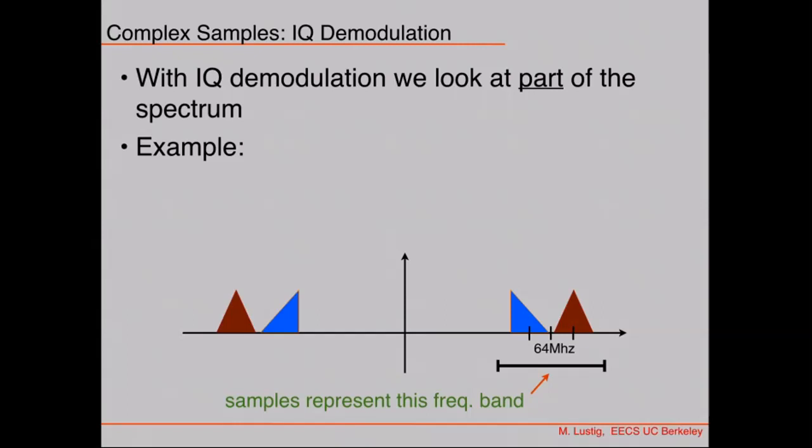So if I have a signal coming from an MR system, let's say 1.5T, the signal that I'm going to get when I apply a gradient is going to have a certain bandwidth around 64 megahertz. And because the signal is real, it's going to also have its conjugate symmetric signal at minus 64 megahertz.